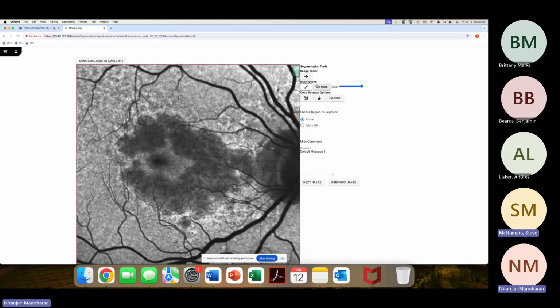And I think, NJ, the other thing too is for this data set, we tried to eliminate that as a confounding variable as much as possible where we could. So there's a couple of images where they're maybe touching, but we wanted to make sure it wasn't really large areas that were contiguous with the PPA.